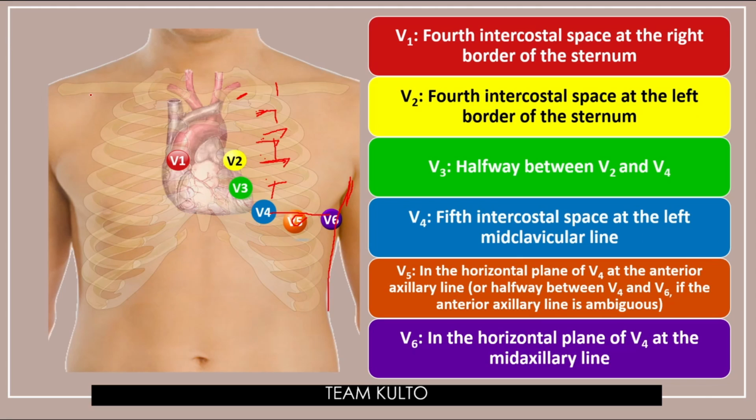Again, this is how you're gonna place your electrodes from V1 to V6. Okay? Malinaw yon? Malinaw po iyon.